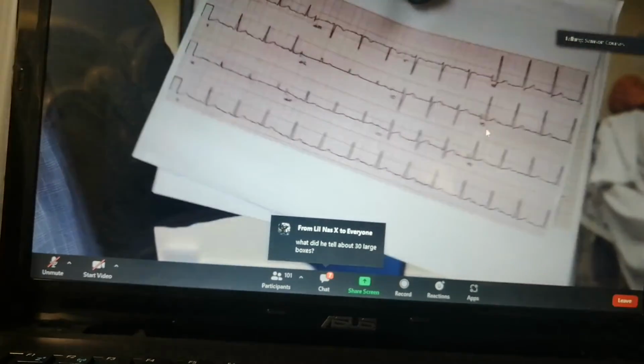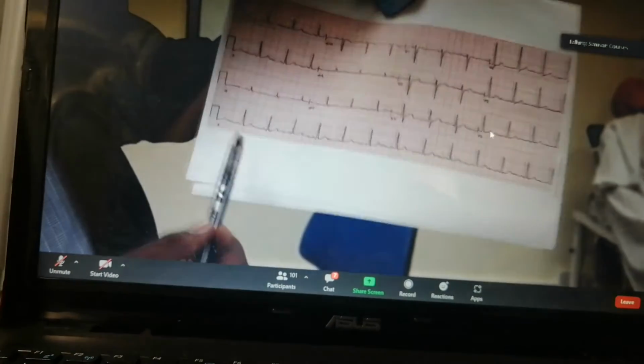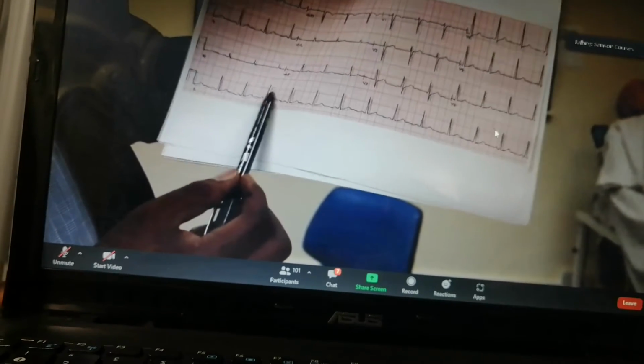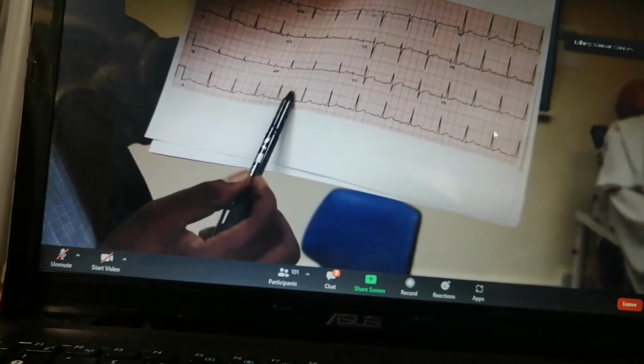So, what about this ECG? Well, let's look at it. First, look at the P, sinus. There's a P everywhere, sinus reading. Does it look regular? 1, 2, 3, 4, 1, 2, 3. It is regular. So this is a normal sinus reading. It looks like a normal ECG. Nothing to worry about. Okay, I've got another one.